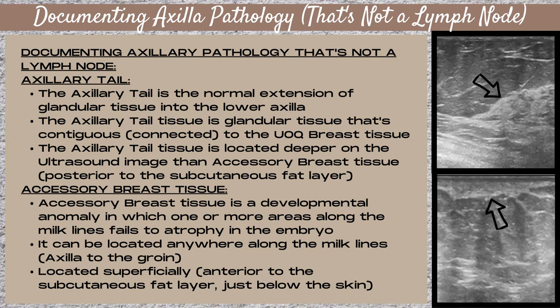The axillary tail is the normal extension of glandular tissue into the lower axilla. This tissue is contiguous with and connected to the upper outer quadrant breast tissue. It is located deeper on the ultrasound image than accessory breast tissue, posterior to the subcutaneous fat layer. On the ultrasound image you'll see the skin line, then fat, then glandular tissue connected to the upper outer quadrant of the breast.